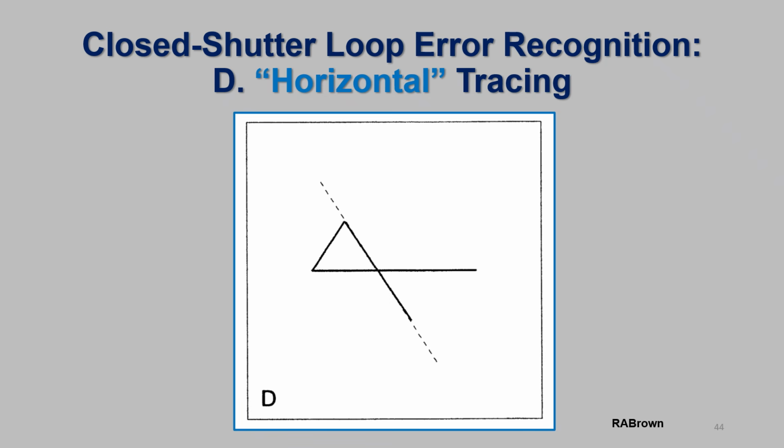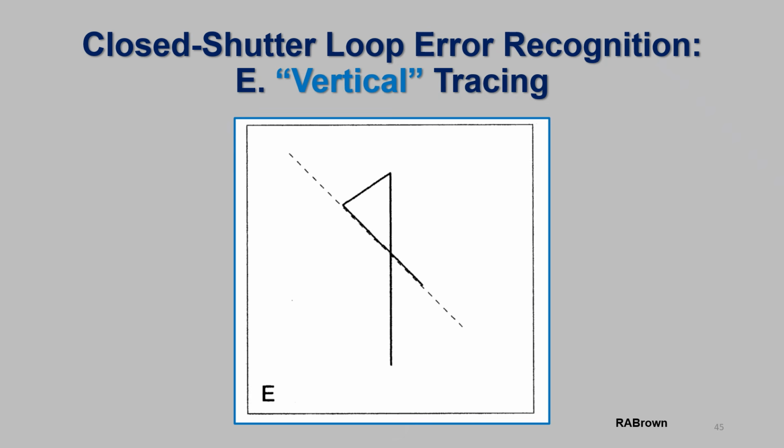A completely horizontal tracing represents box pressure changes without mouth pressure changes. This is often observed by the subject's tongue blocking the mouthpiece, or by the subject essentially holding in a breath and simply moving their body, generally the shoulders. A completely vertical tracing represents mouth pressure changes without box pressure changes. This is often observed when the subject generates mouth pressure changes with the cheeks while not moving the thoracic cage.